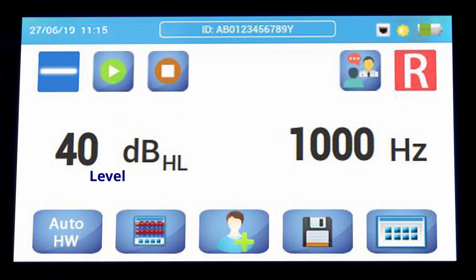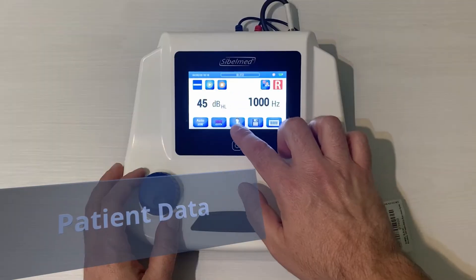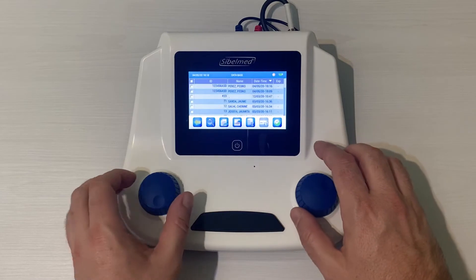The screen also shows the intensity in dB, the frequency in Hz, the test results, the new patient icon, the disk to save the test, and the configuration menu. To start the test, we need to create a new patient or select one from the database.